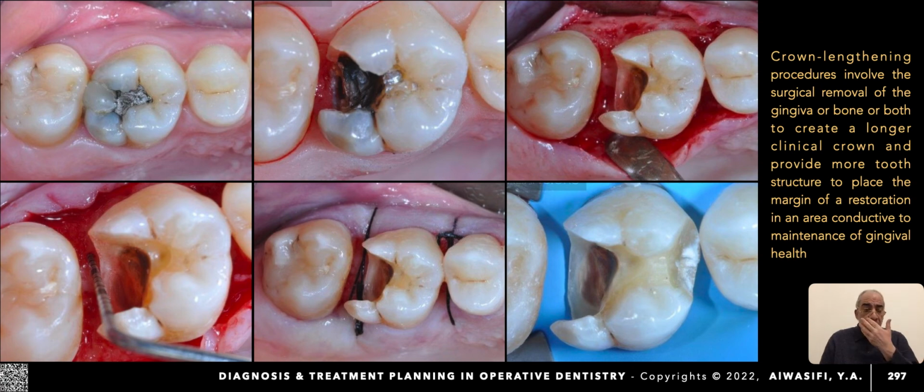After complete healing, you can note how clear your gingival floor is now, and you can apply your rubber dam, apply matrices, and go for all the bonding procedures without irritating your gingival tissues and without your gingival tissues jeopardizing or destroying your bonding procedure.